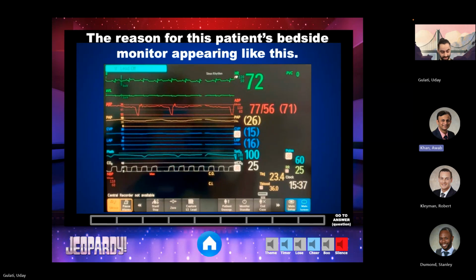So there's still some innate activity. The heart is so weak that they're not generating any pressure, but at some point they're still able to generate some pulse. So you'll still sometimes be able to detect a pulse in the patient, but it's not going to be strong enough to detect in every catheter that you have in place. That was my understanding. I don't know if that's the right explanation, but I've looked at this image for a while.